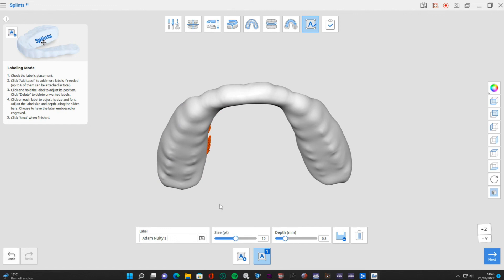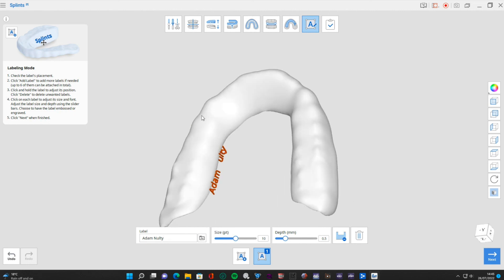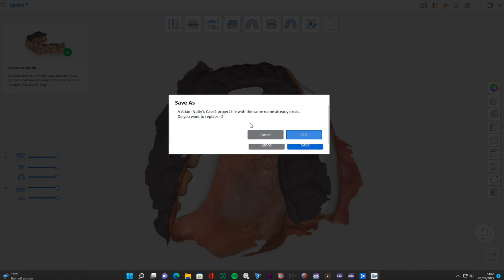Finally we can load up whatever text we want on the surface. I don't tend to do this - I think it's just a plaque trap that people's tongue will play with. Some people do it though, so you can add that if you want. I'm going to delete it, click OK, and then save it. The project name already exists so I'm going to click cancel.